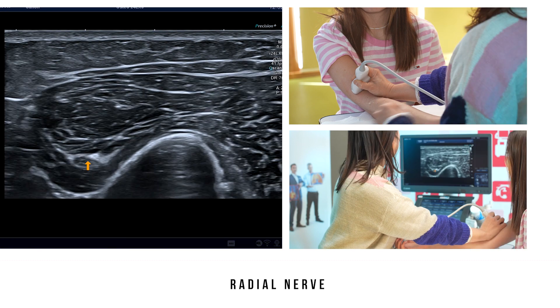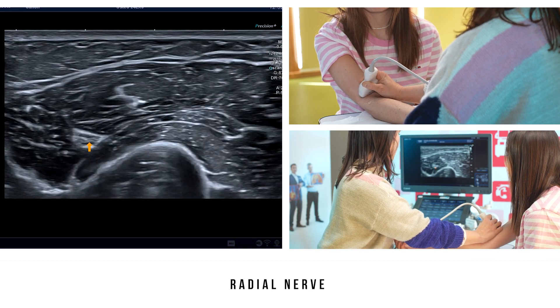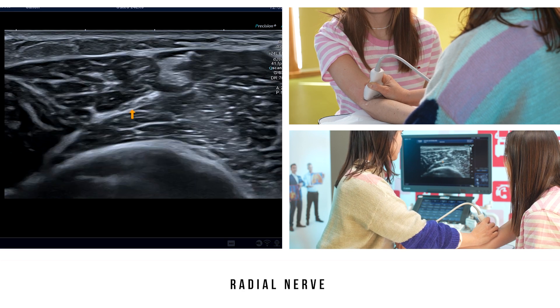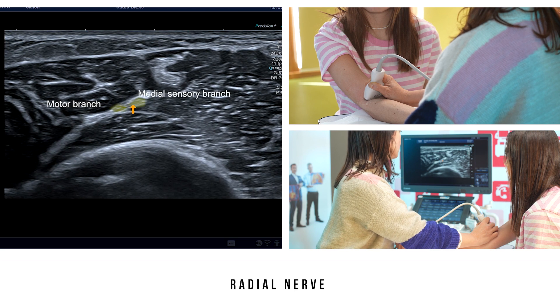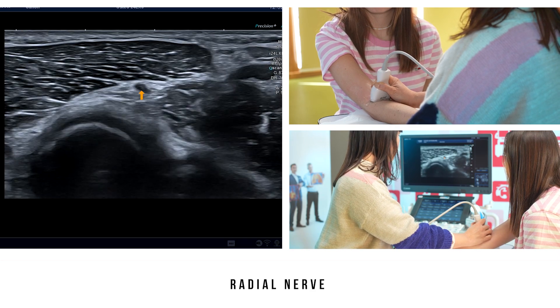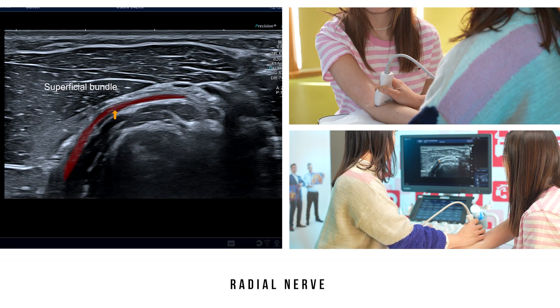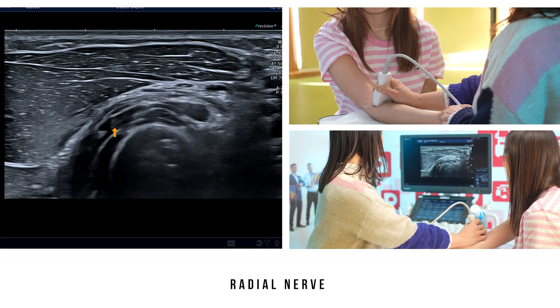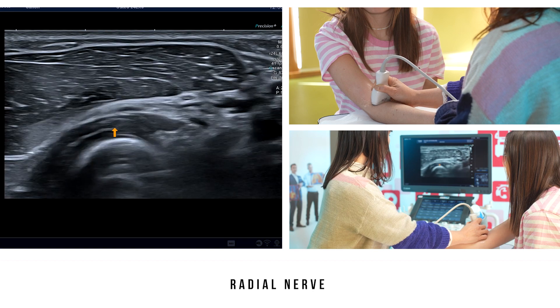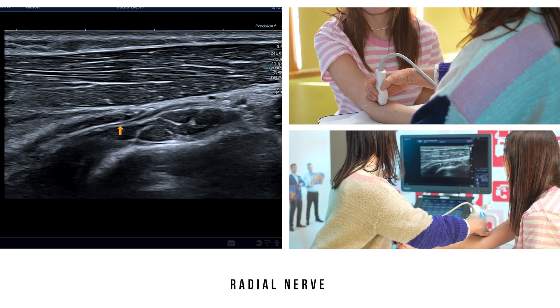The last step consists of analysing the radial nerve. After piercing through the lateral intermuscular septum, the radial nerve sits in the anterior compartment of the arm, where it initially runs between the brachialis muscle deeply and the brachioradialis muscle superficially. It quickly divides into two branches: a lateral motor branch and a medial sensory branch. The lateral motor branch positions itself between the two bundles of the supinator muscle. Having the patient do pronation-supination movements makes it easier to analyse this branch because there is less compression between the two bundles during pronation. At this level we can shift to a sagittal section and see the radial nerve penetrate between the two bundles of the supinator under the arcade of Frohse.